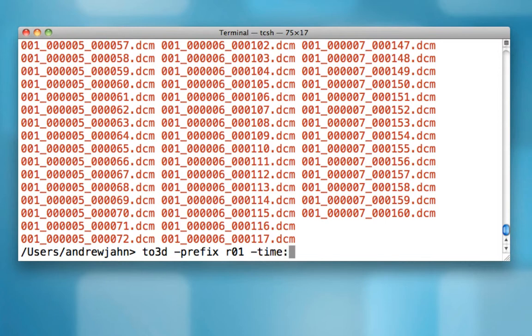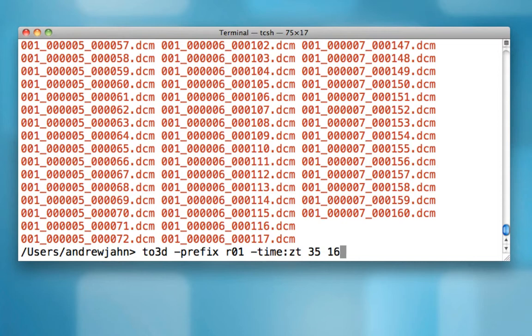to3d also needs this -time argument. And this :ZT means that it was acquired first in the Z direction and then in time. And this time argument requires four sub-arguments. It needs the number of slices, which I know from my scanner notes is 35 slices in the Z direction. It needs the total number of time points for that run, which is 165. It needs the repetition time in milliseconds. And here again, I also know from my scanner notes that it is 2000 milliseconds for each repetition time. In other words, how long did it take to acquire an entire volume?